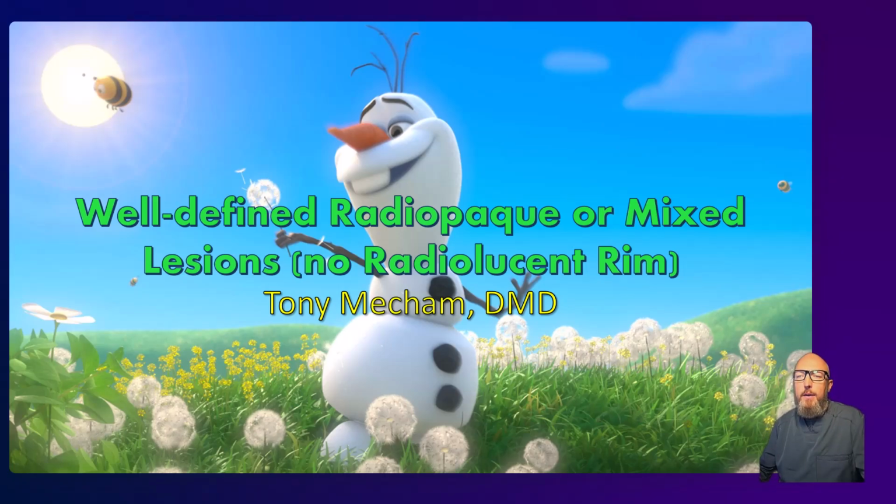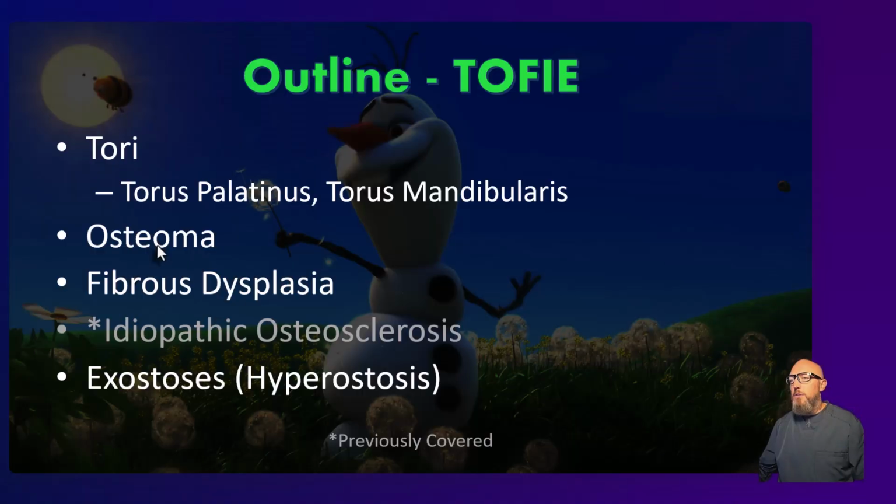Get your study guide out and keep your chart handy. So the acronym to remember all these lesions that belong on this differential is TOFIE, to remind you that it's kind of hard, just dense lesions in the jaws with no radiolucent outline. So Tori, Osteoma, Fibrous Dysplasia, Idiopathic osteosclerosis, which we've already covered, and hyperostosis, exostosis for the E. But I'm going to go ahead and cover that right at first, because these are all just kind of variations of the same thing, proliferation of dense bone. I would think of osteoma similarly as well.